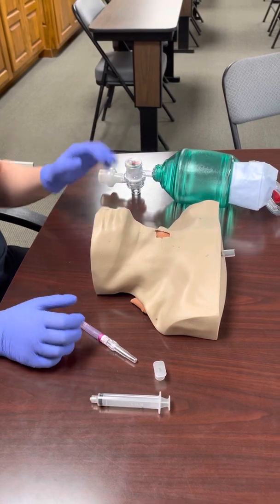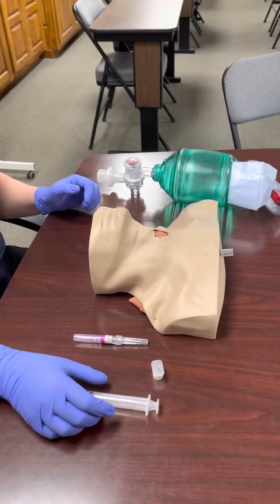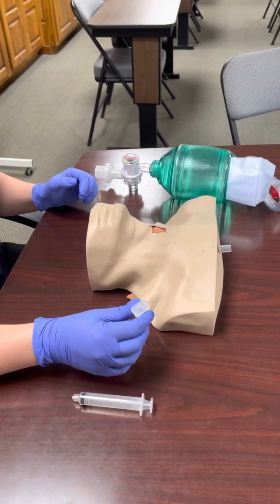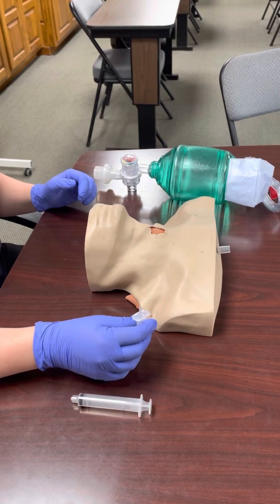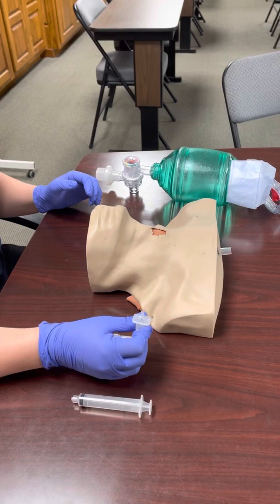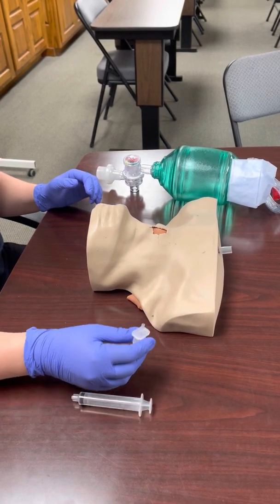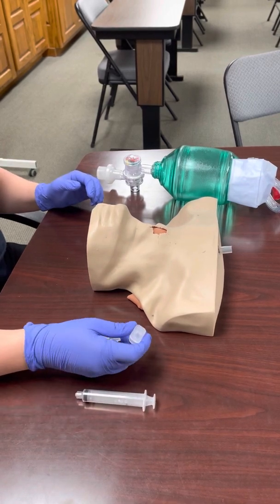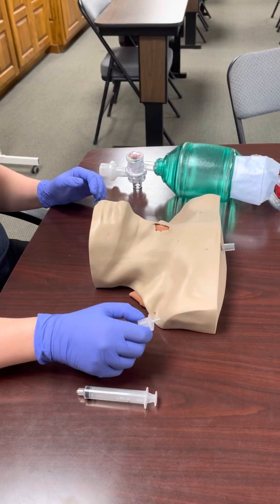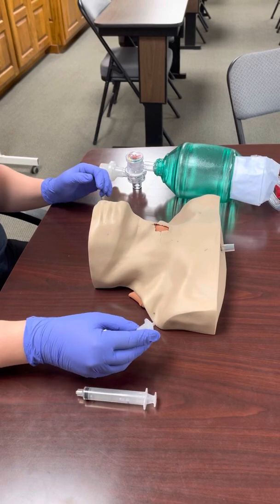Supplies you'll need: your BVM, a 14 gauge needle, a 10cc syringe which is optional, and a size 3 or 3.5 tube adapter. We have our needle cric kit already set up with a size 3 tube adapter. We've taken this off an ET tube and placed it with our 14 gauge catheter in a little bag so we have it ready to use. This will hook into the catheter and then you can hook up your BVM to deliver oxygen.